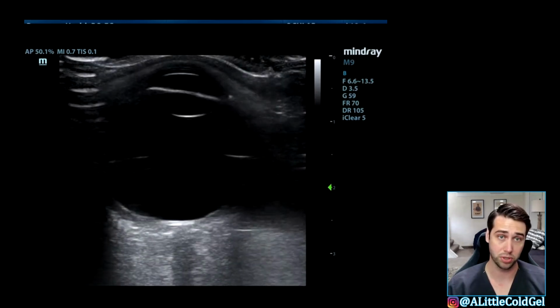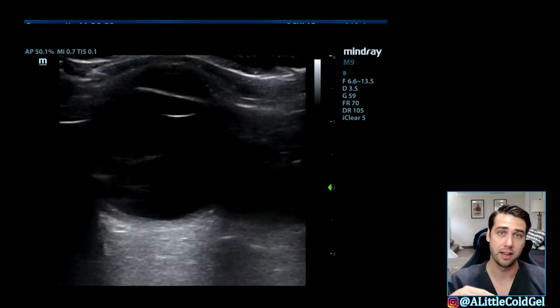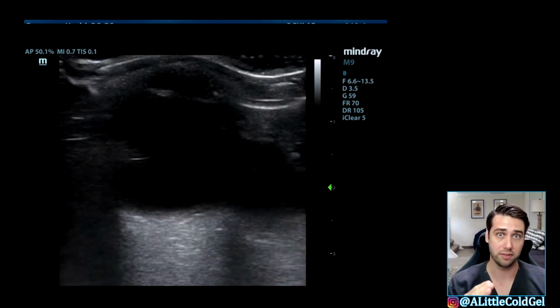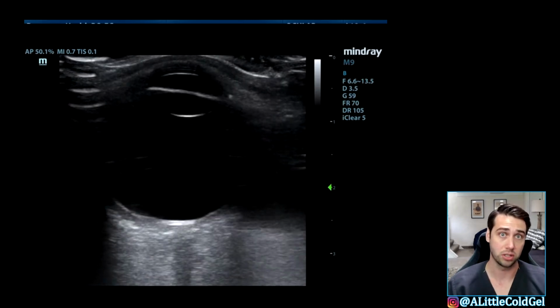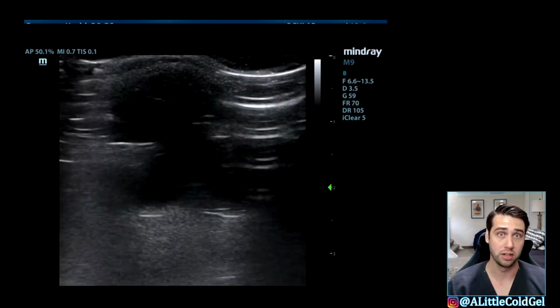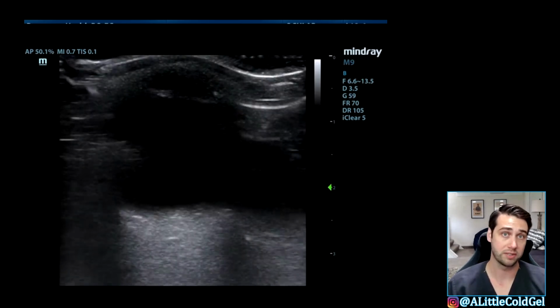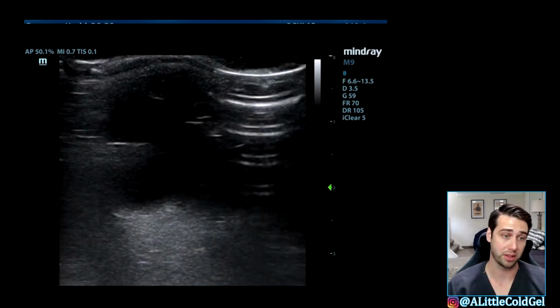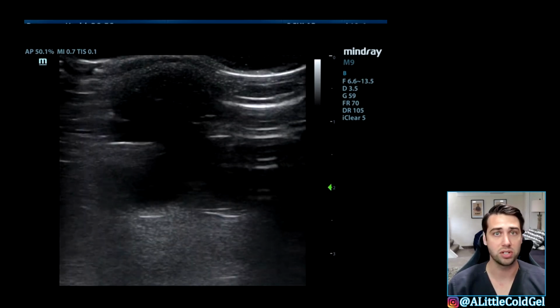You see this person is fanning back and forth. So what you want to do is you want to put the probe on the eye, fan back and forth, and then rotate and fan a couple more times so that you can really see all areas of the retina, closely observing that back wall for any sort of irregularity, because any bump or any fluid collection back there could represent pathology.